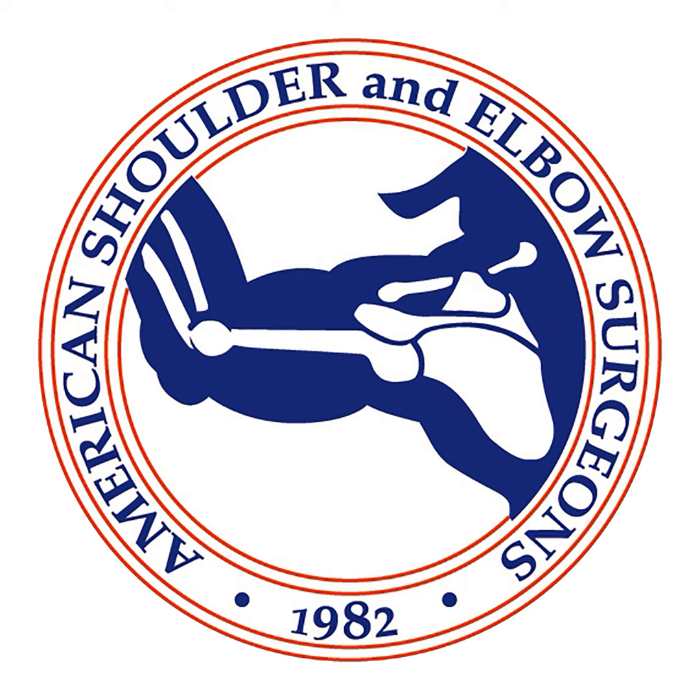So I agree totally with John that stemless is going to be the way of the future for anatomic and reverse. However, we will always have a need from time to time for a stemmed implant. You can do all the pre-op planning in the world and scrutinize x-rays and think, this is going to be great for stemless. We're all set to go. And then in the operating room, you may find that the bone quality is not good enough for a stemless implant. So it doesn't happen often, but it does.